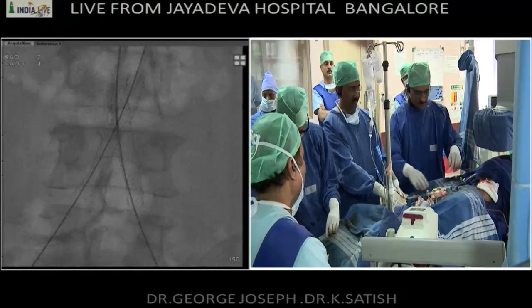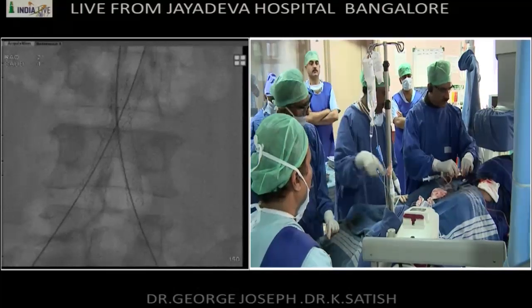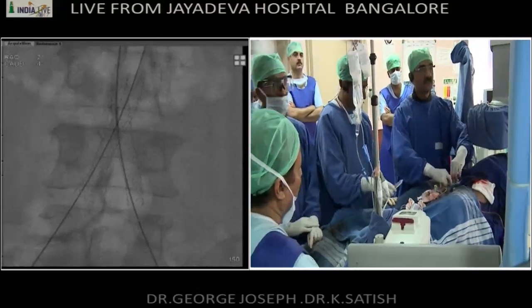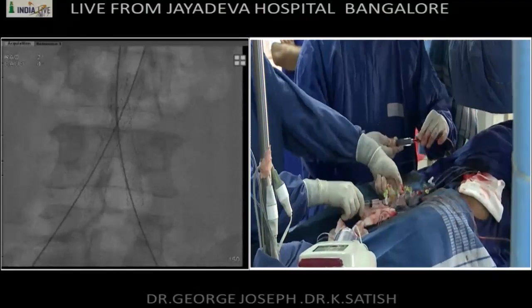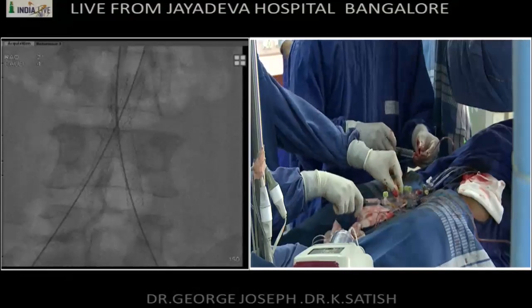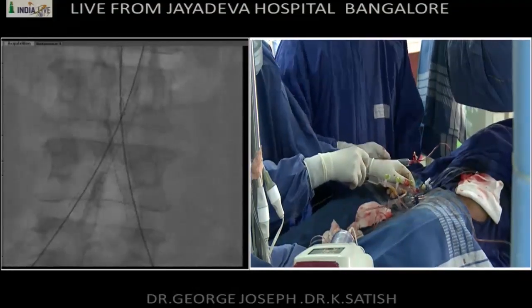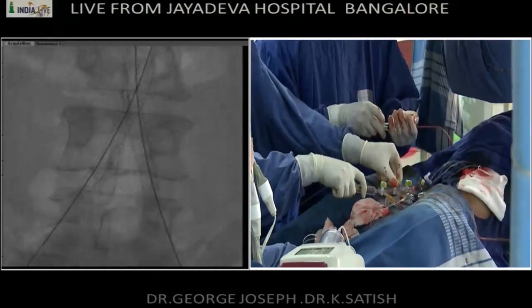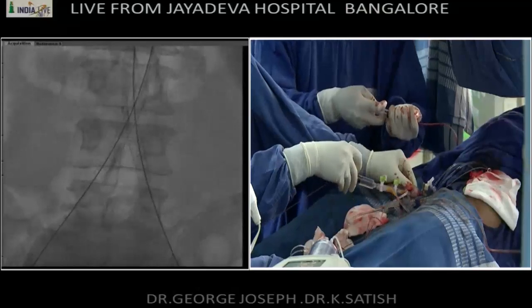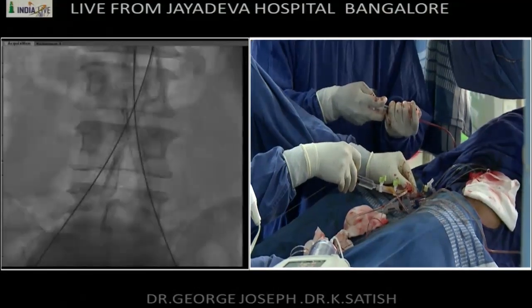So let's do an angiogram. We'll just do a hand shot through the sheaths. Get contrast. We'll do a bilateral. You inject from there simultaneously. Show lower down, please, a little bit. Okay. Ready? Yes. When I say 3, you inject. Okay. 1, 2, 3.